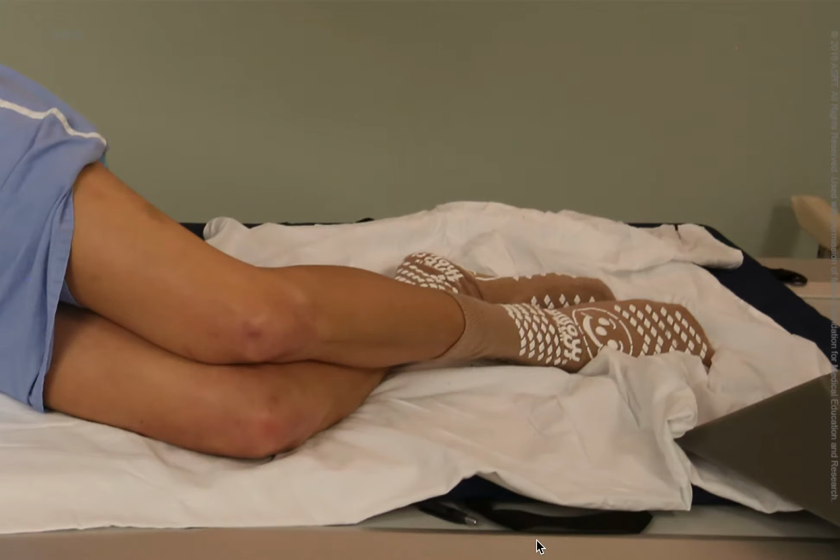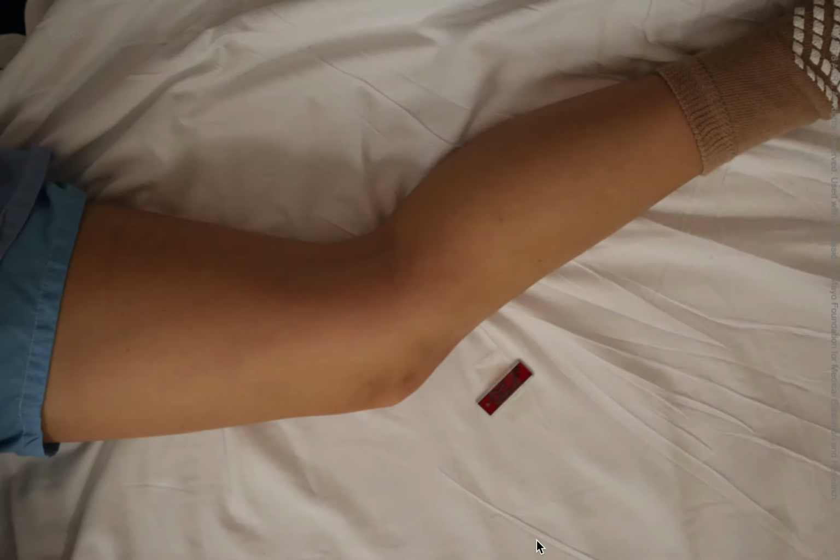Positioning for the lateral projection begins with the patient lying on the affected side. Draw the unaffected leg forward and rest it in front of the affected leg. If needed, use a sandbag or positioning sponge to support the ankle of the affected leg. Have the patient flex the affected knee slightly, between 5 and 10 degrees. Note that a greater degree of flexion will result in narrowing of the patellofemoral joint space. The image receptor is centered to the patella.